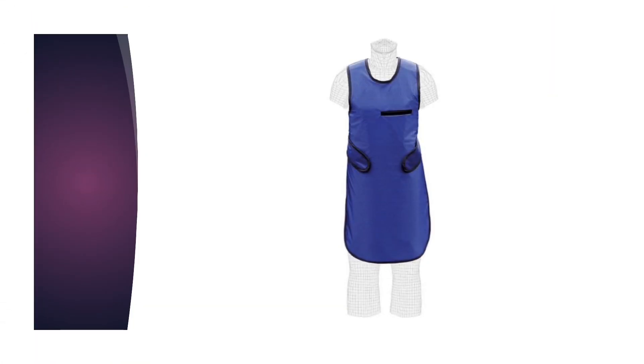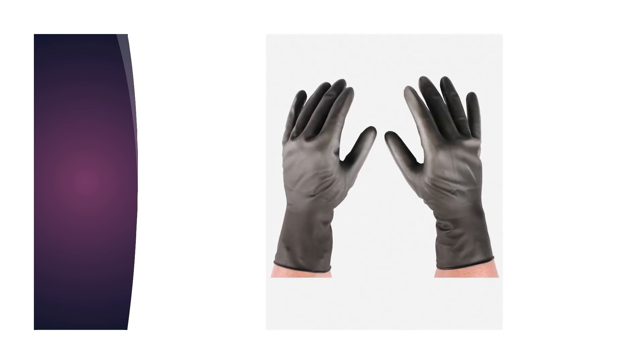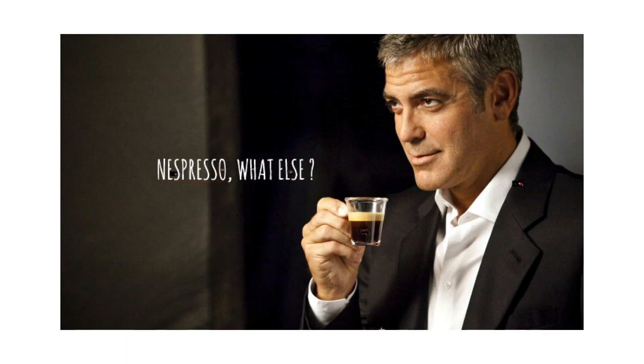Currently, lead apron, thyroid protector, lead gloves, and glasses are practical devices. What else?